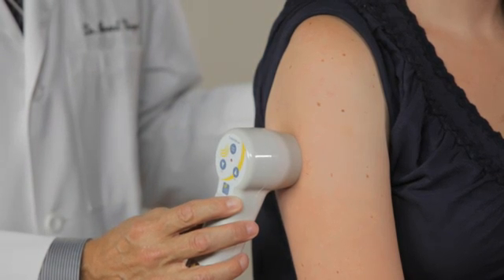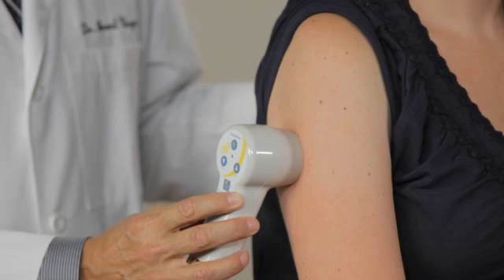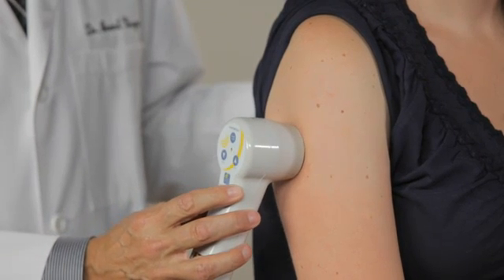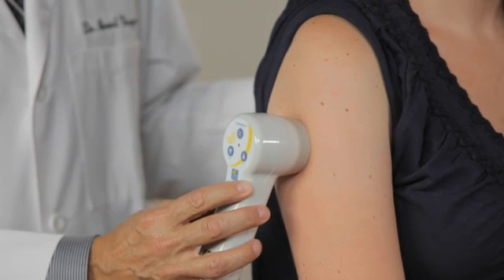Again, we heard the beep, the light turns red. That tells us to stop. We will lift, reset the emitter head. It is now treating the individual at that particular point and we will hold it in that point until we hear the beep or see the red light.